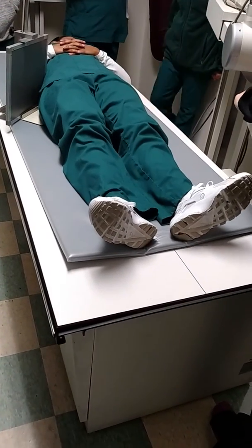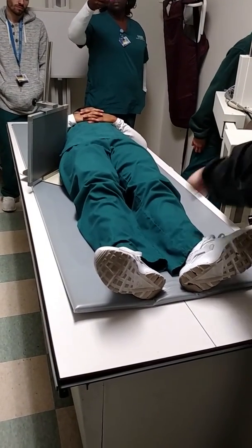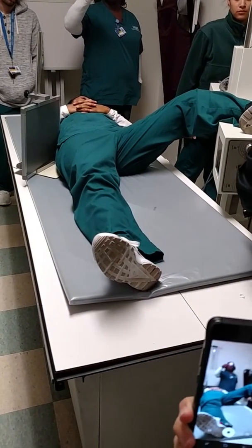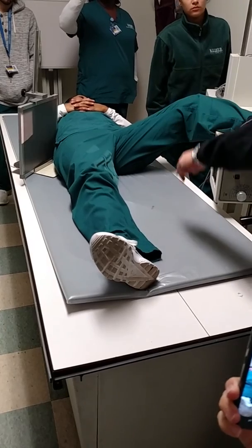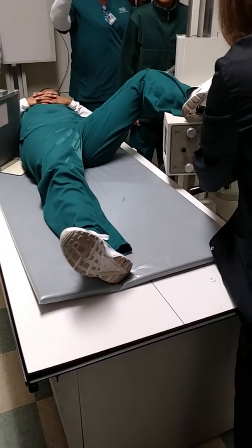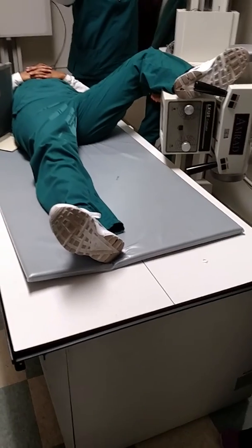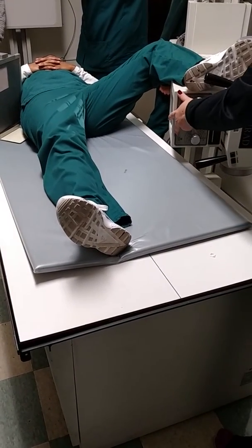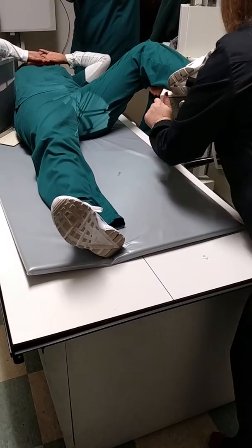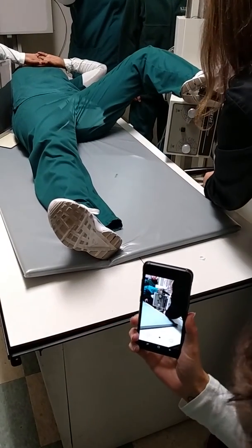I now have to get my CR perpendicular to the IR. So I'm going to angle. And I'm going to take this leg that does not hurt you and hike it up there. Now you can see that my CR, I can't quite get it low enough. Ow! That's a crotch stretcher. I can't quite get it low enough, so what has to happen, I'm going to unlock this, which we have not yet used, and then I'm going to take this, and now I can shove it in, and loosen a little bit, shove it in. This has no tube angle, just so that I can get this handle below the tabletop.